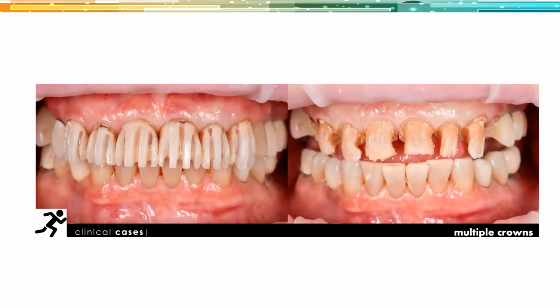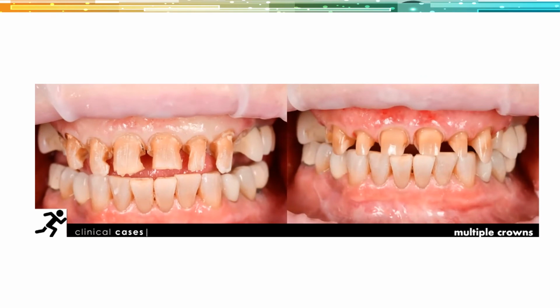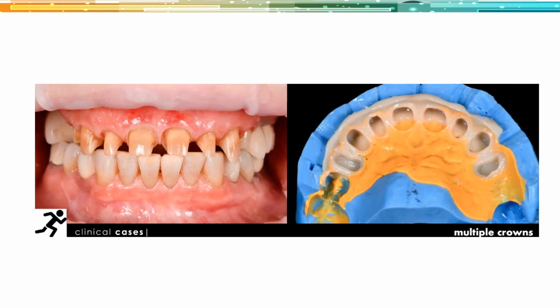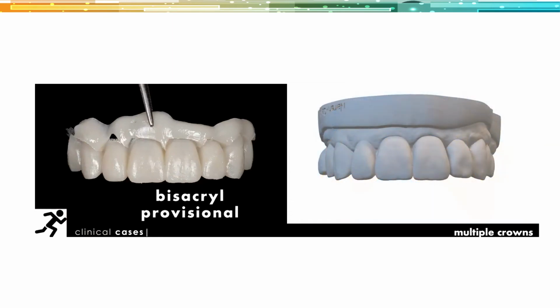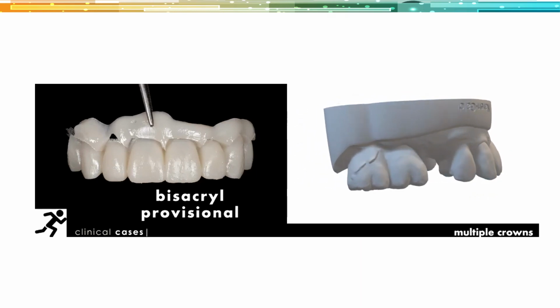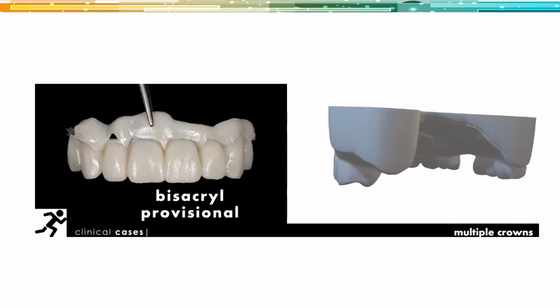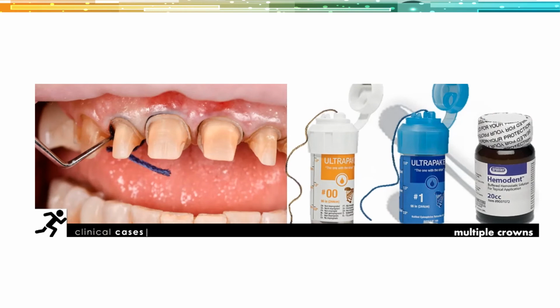Basically this is not complex dentistry. I'm sure all the people on the call tonight are doing these kinds of cases. I cleaned up all the decay. I did the preparations and the buildups where I needed them. Then I'm going to use that matrix again to create provisionals. When I take this provisional out of the putty matrix, it's really neat because now I'm holding something in 3D and it's exactly what was designed on the computer screen. Something that we design with clicks is now something that we're holding in our hands. I really think that's a great way not to play telephone.